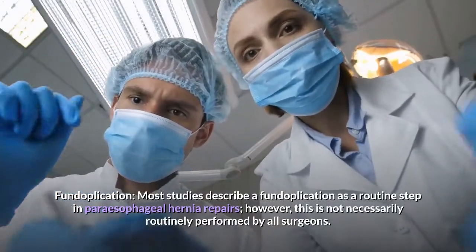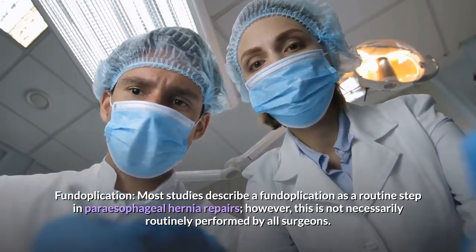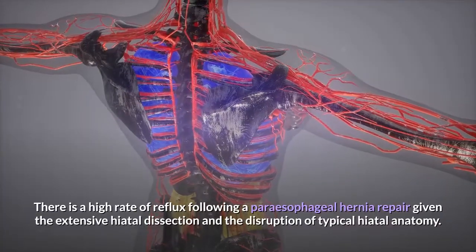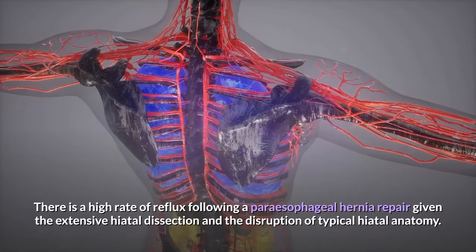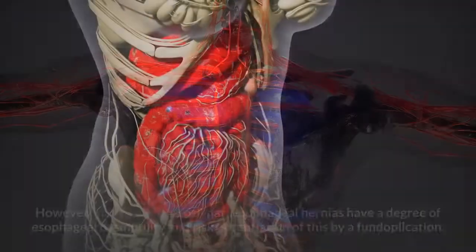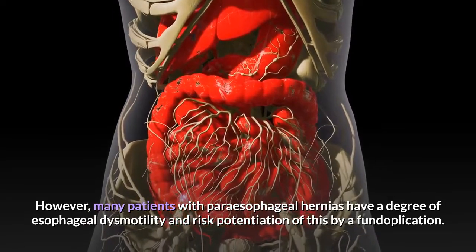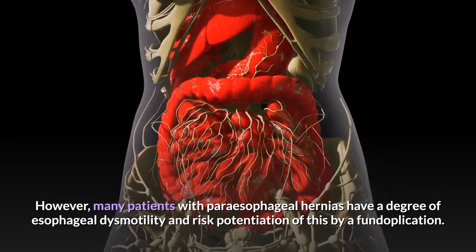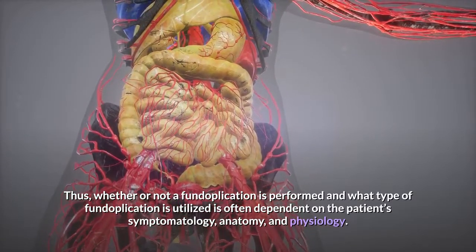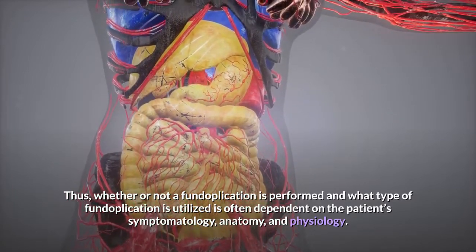Fundoplication. Most studies describe a fundoplication as a routine step in paraesophageal hernia repairs. However, this is not necessarily routinely performed by all surgeons. There is a high rate of reflux following a paraesophageal hernia repair given the extensive hiatal dissection and the disruption of typical hiatal anatomy. However, many patients with paraesophageal hernias have a degree of esophageal dysmotility and risk potentiation of this by a fundoplication. Thus, whether or not a fundoplication is performed and what type of fundoplication is utilized is often dependent on the patient's symptomatology, anatomy, and physiology.